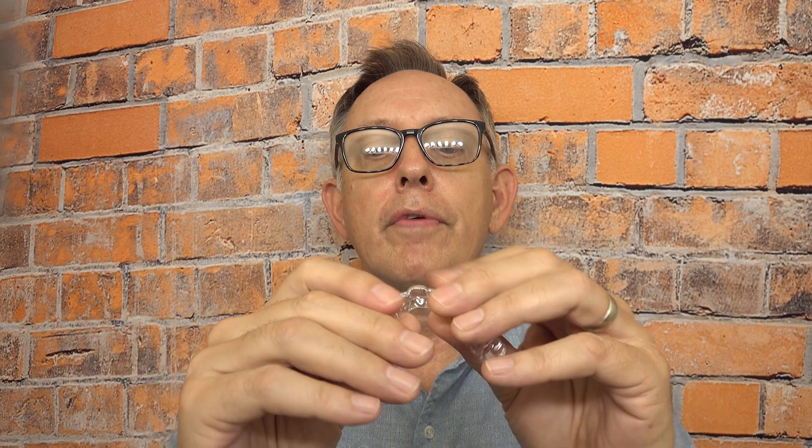Those went in fairly easily and the lisp is back. I can feel them covering pretty much the same teeth as before, and the top will do the same — so I know what teeth will be moving and pretty well know what to expect. The top trays are beautifully clear, molded, scalloped. Here we go with the top. I had to grab a chewy off camera — they dropped in fairly easily but weren't fully seated, so I bit down and the top one popped right in.